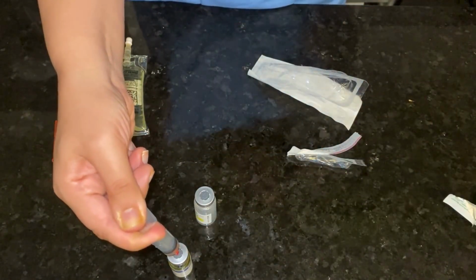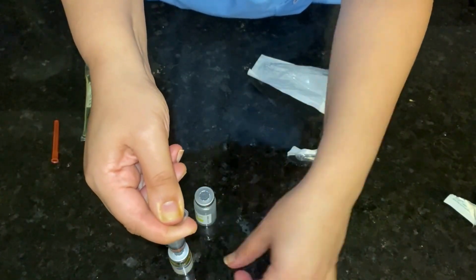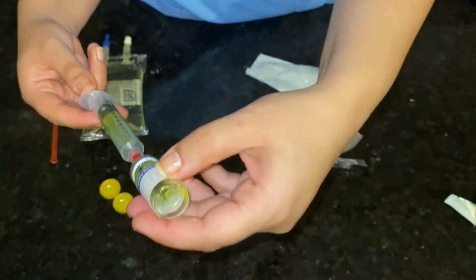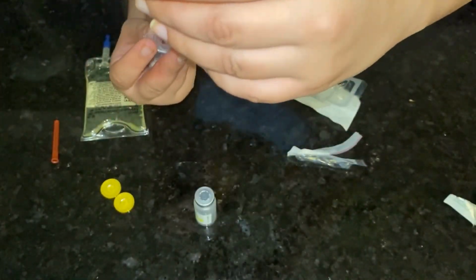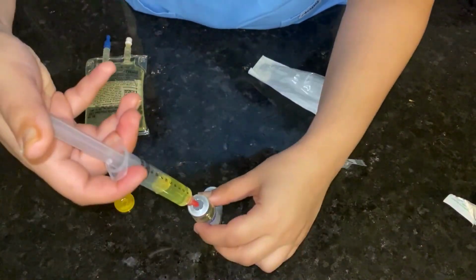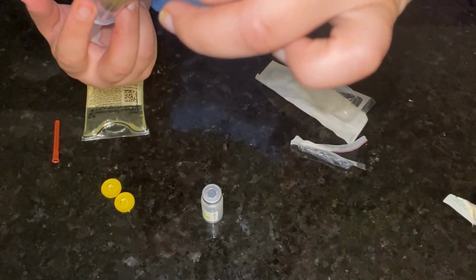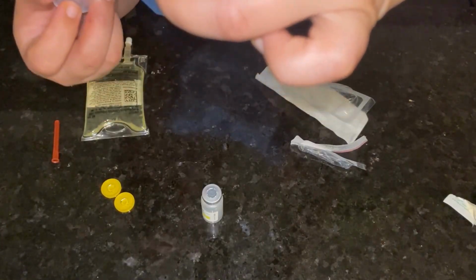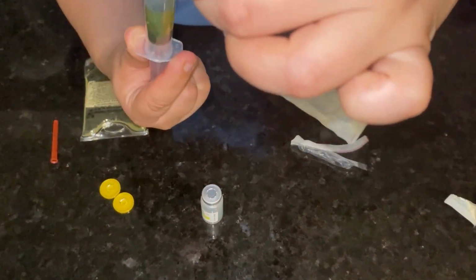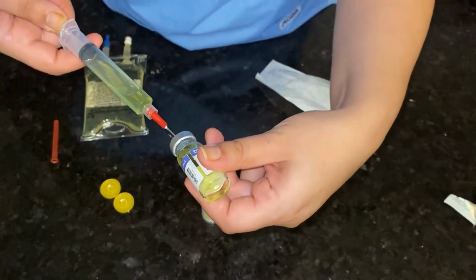Okay. Now I have to get 7.5 of that and add it to my piggyback. So I will take 7.5. Be sure that there is no residue, that it's completely dissolved. A little more. Okay, it should be from the area where the air is not inside.